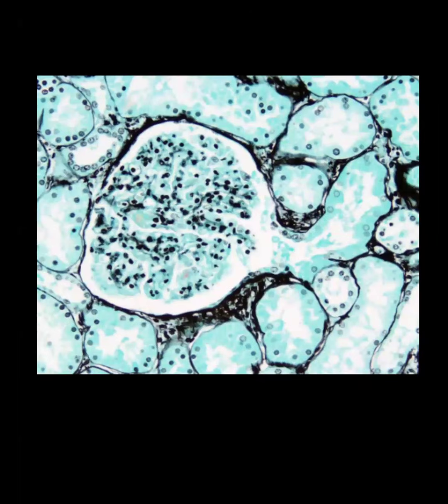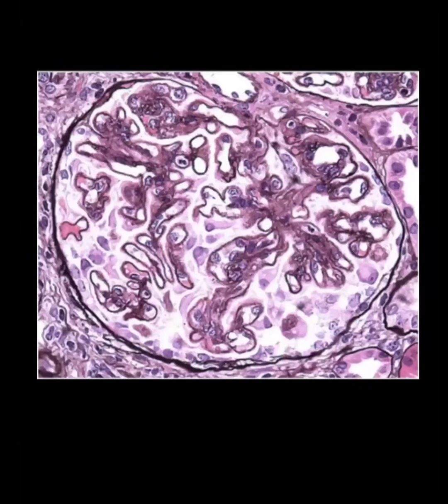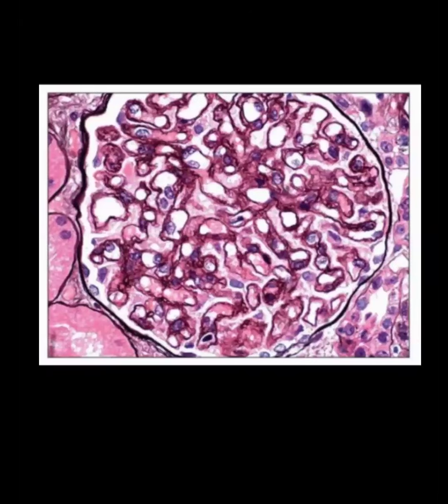So you should be very careful. You are checking the glomeruli, because the glomerular capillaries are black. So it is again Jones methenamine silver stain. Again, the glomerular capillaries are looking blackish. So it is the silver stain for you people.